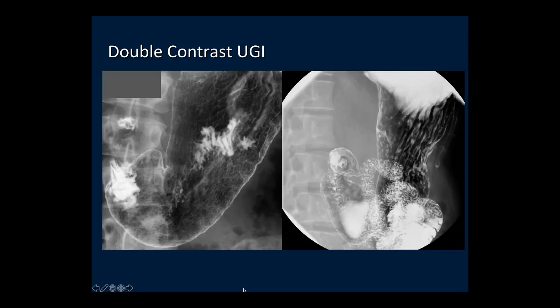This slide shows two normal stomachs on double contrast upper GI. On the left, we see the normal mucosal pattern of the body and antrum of the stomach, characterized by a lacy-like network called the area gastricae. On the right, we see the normal rugal folds that run along the long axis of the stomach. The normal thickness of the rugal folds varies with the degree of distention.